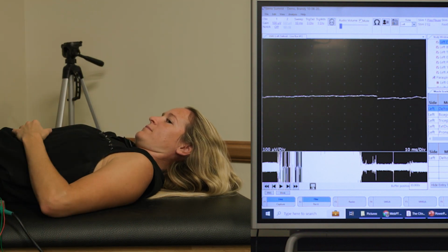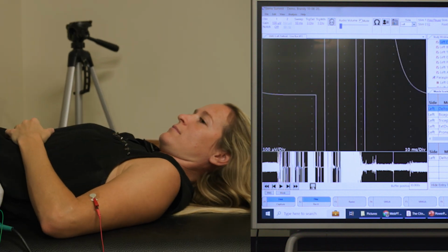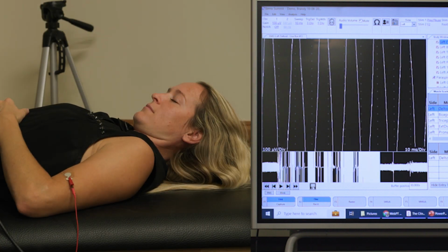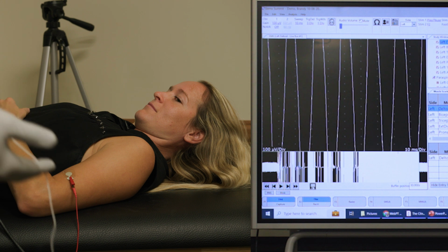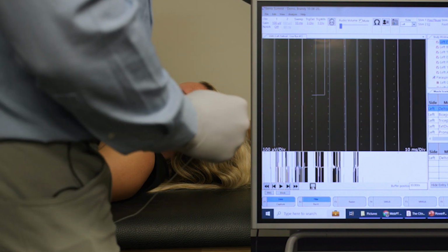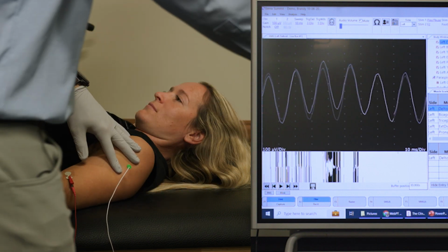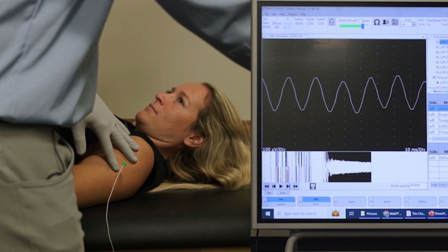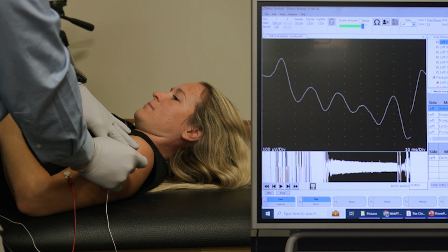So Dr. Shwari last week introduced this a little bit. We look at the muscle when it's at rest and when it's contracted to analyze the motor unit activity. All right, so we're going to start in the deltoid here, a little prick here. And usually we have a pretty flat baseline. With other electrical stuff plugged in, it'll be a little wobbly, but we can still get the main idea.